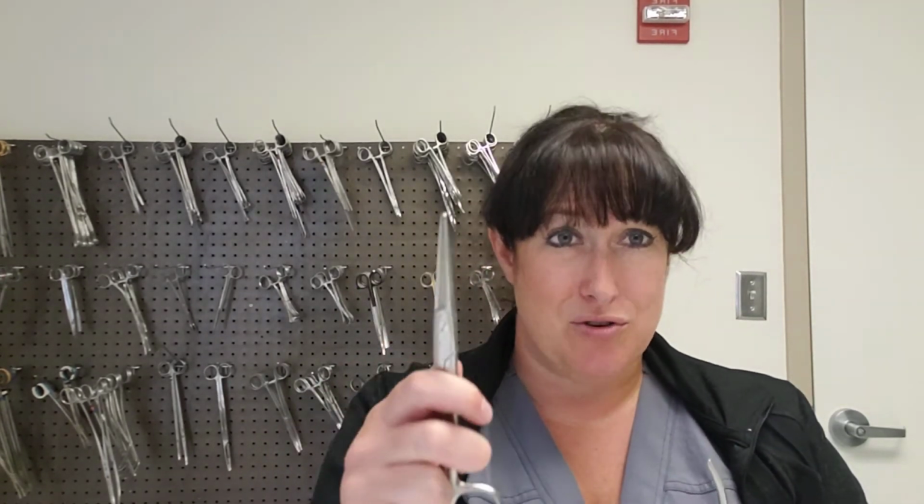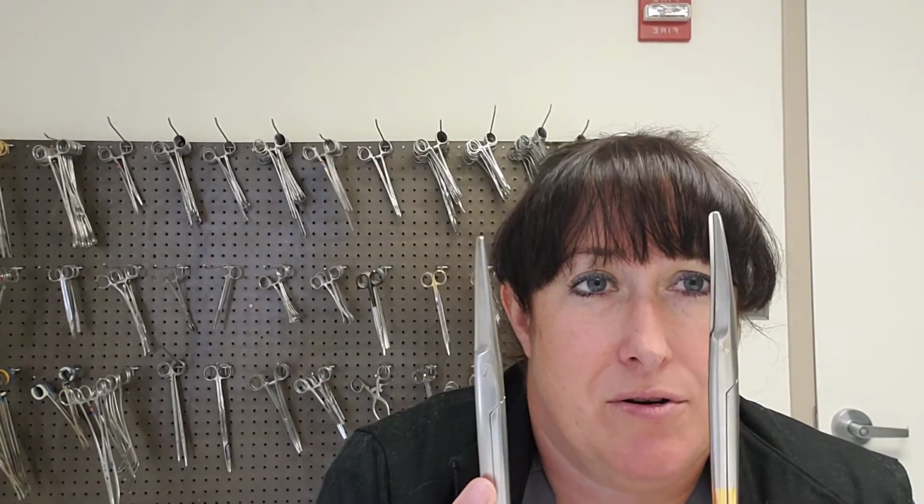Because of the heavy material that you are allowed to use these on, these would never be appropriate for tissue. With that being said, your curved Mayos and any other dissecting scissor that you would use on human tissue, you should not use to cut any non-tissue things with. So you would never use this to cut suture. You would never use this to cut mesh or drain. Only use your straight scissors because you don't want to dull these, right? It costs money to have these things sharpened. So these are your two scissors.